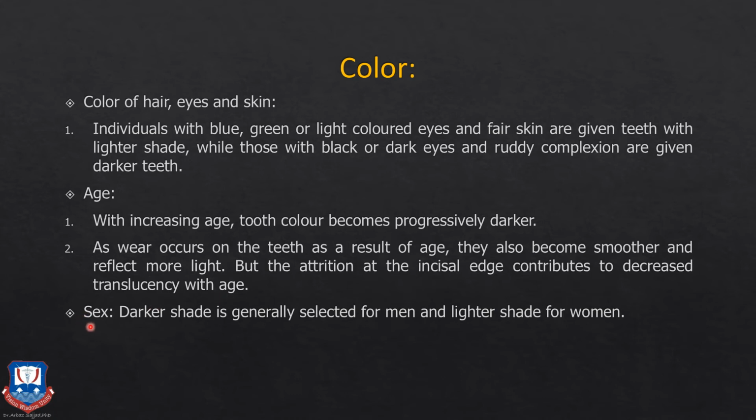The sex again will also determine the shade. For males we generally tend to use a darker shade, whereas for females we prefer to give them lighter shades, because it is a general preference of theirs also.